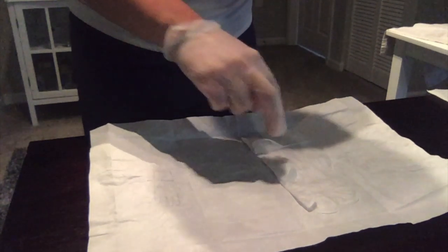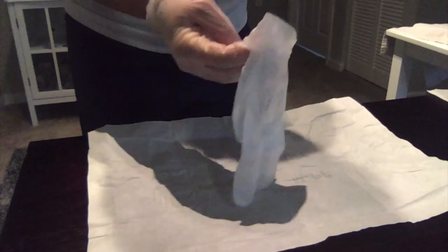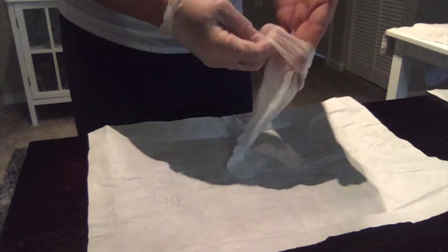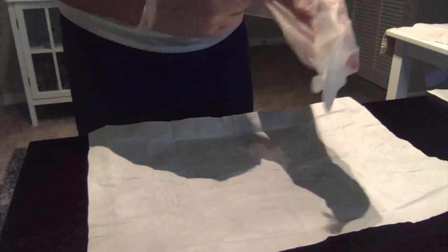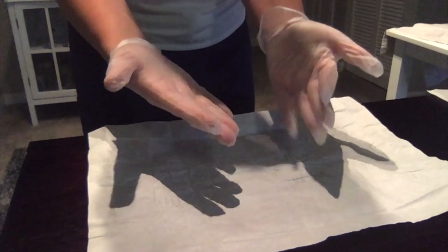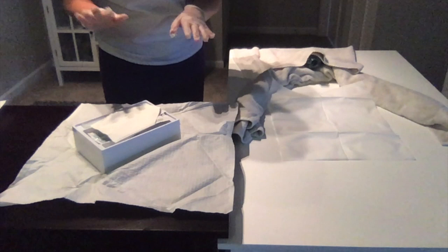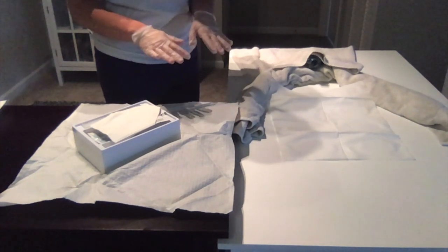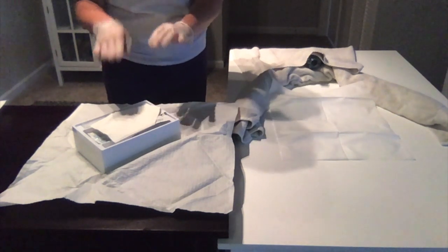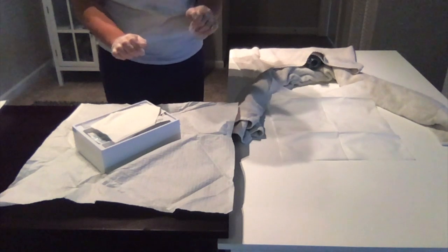Then I'm going to grab this. I can grab the inside because this hand is sterile. And I can go ahead and put my hands in this way, but maintaining sterility, like that. So once I have put my sterile gloves on, I have my field to work with and then where my catheter is. So all of this is sterile. This right here, this cath kit, and then this is also sterile.